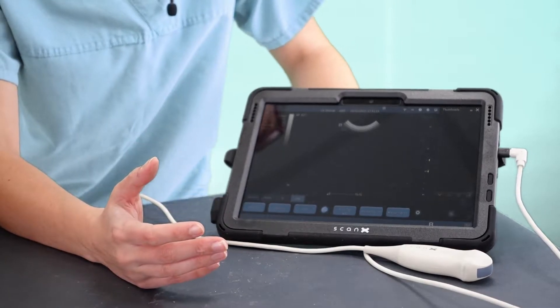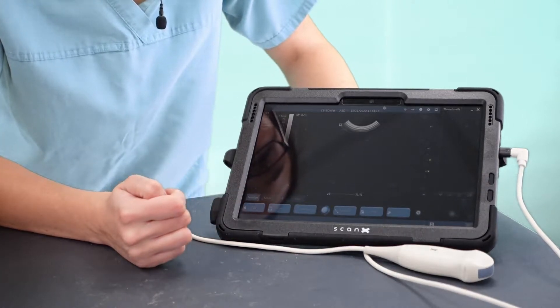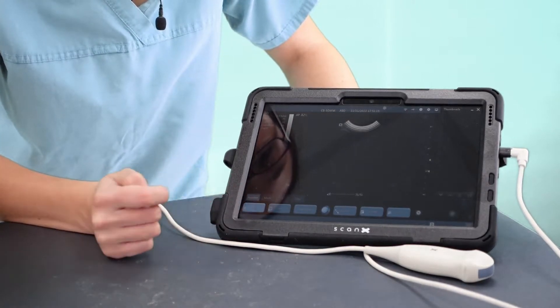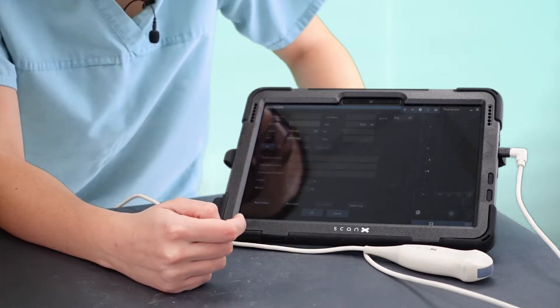Hello, today we're going to show you how to do a quick cardiac screen using the ScanX ultrasound machine. You can start scanning from the moment you turn this machine on, but if you want to set up patient information, you go to Function and Info, and this is where you can put as much patient information as you like.